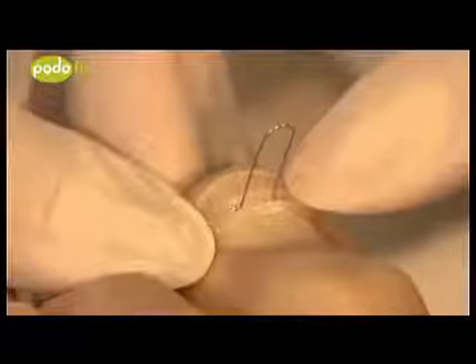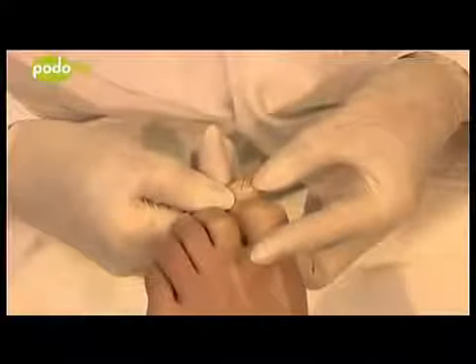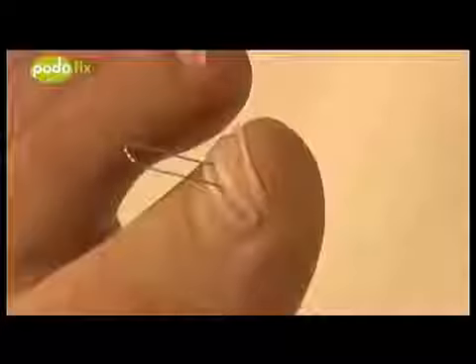If adhering does not work the first time, the nail must be completely freed from adhesive and then completely cleaned. Use a new brace and ensure that only a small amount of adhesive is used.